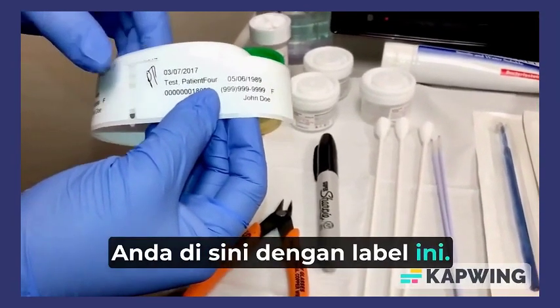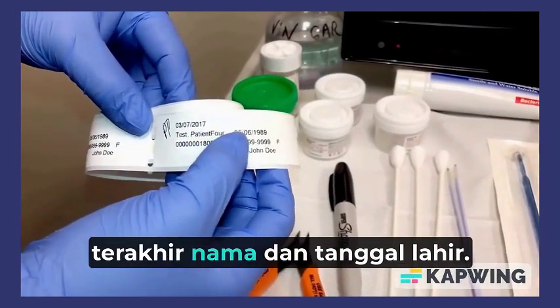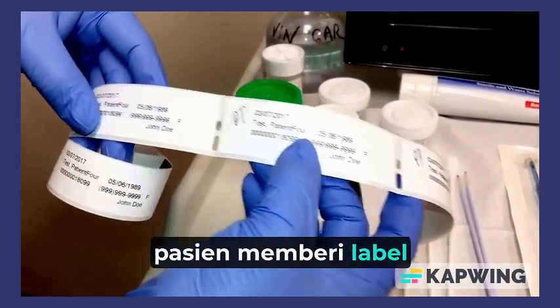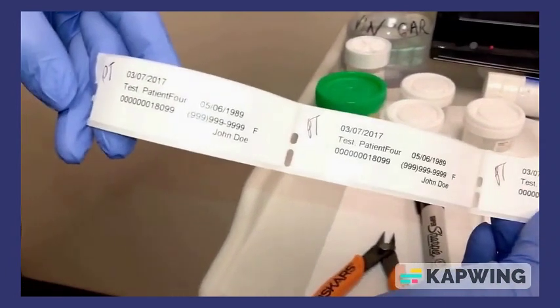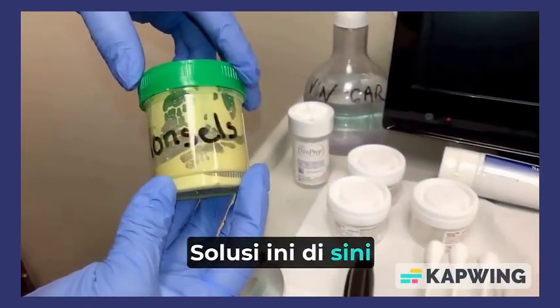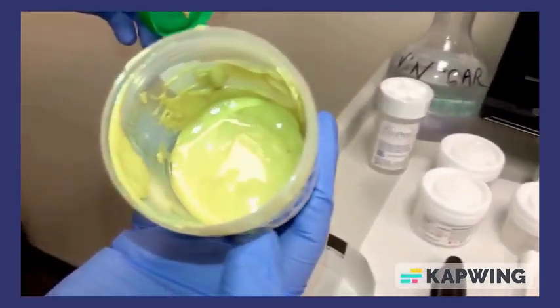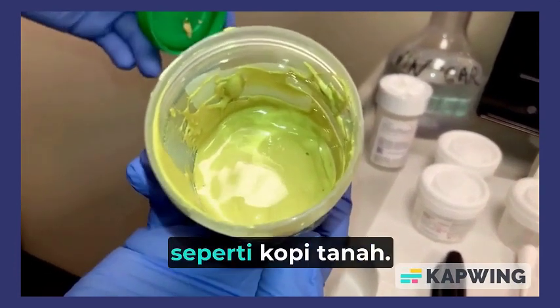Here with these labels, it has the patient's initials, which confirm their first name, last name, and date of birth, and you want to be sure that the patient does label every single one. This solution here is called Monsel's. It has a mustard-like appearance. This goes onto the cervix, which then comes out looking as coffee grounds.